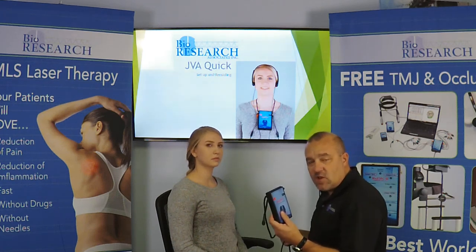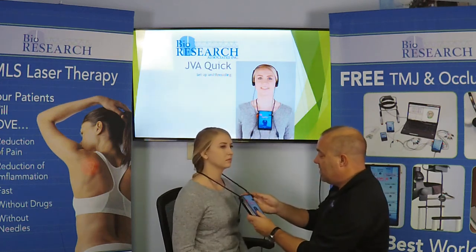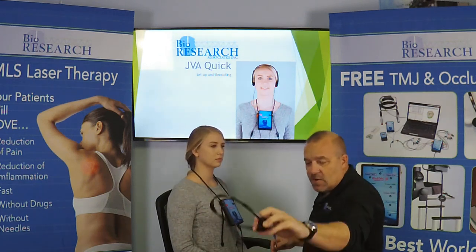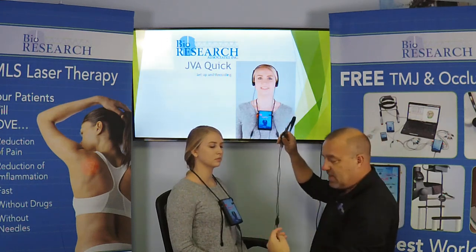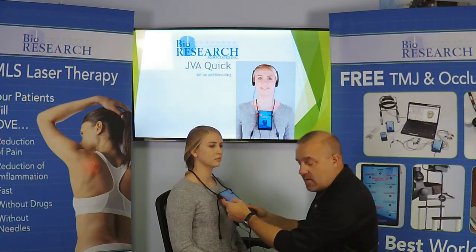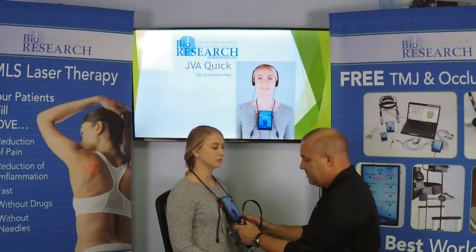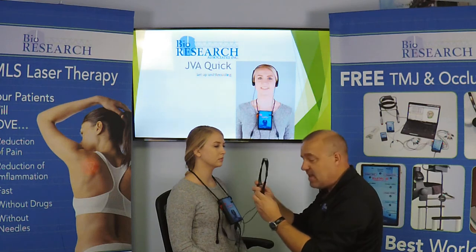So to place the joint vibration analysis system on the patient, we have this little neck band here. Just put it around the patient's neck. Let it hang loosely. You can tighten it here. Bring it up a little closer if you'd like. We take our JVA headset, keeping in mind that the right sensor is the one with the red plug. We'll plug that in to the port. If you have the EMG3, joint vibration analysis inlet ports are on the bottom of the amplifier. If you're using JVA USB like I am here, they're on the top. So we just go ahead and plug those in, making sure that we keep the right sensor on the patient's right side and the left sensor on the patient's left-hand side.